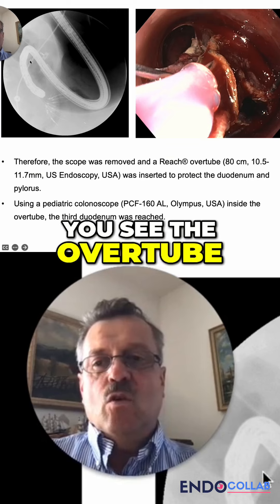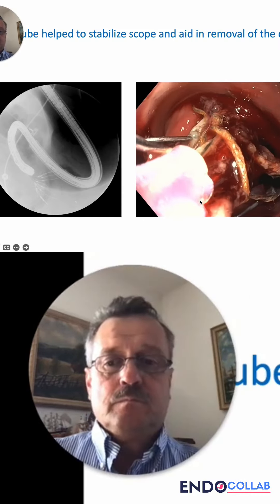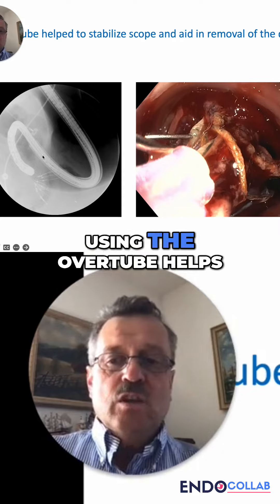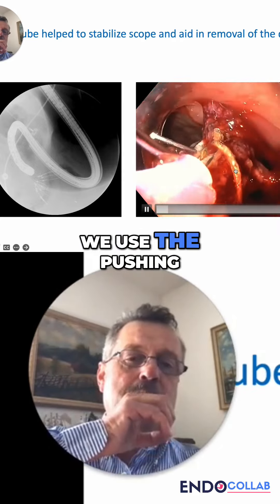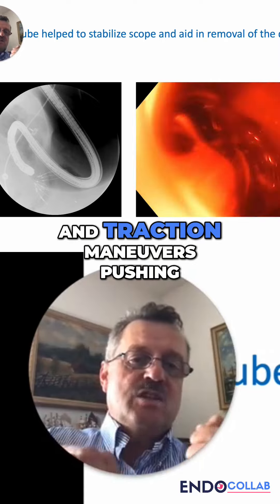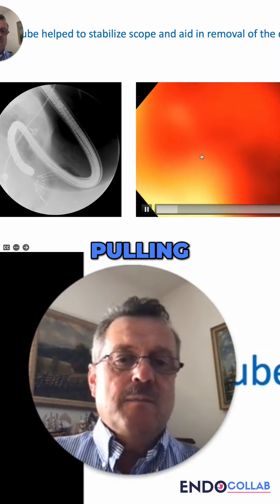Here you see the overtube in a pediatric colonoscope. Using the overtube helps stabilize the position because we use pushing and traction maneuvers — pushing the overtube forward and pulling inside.